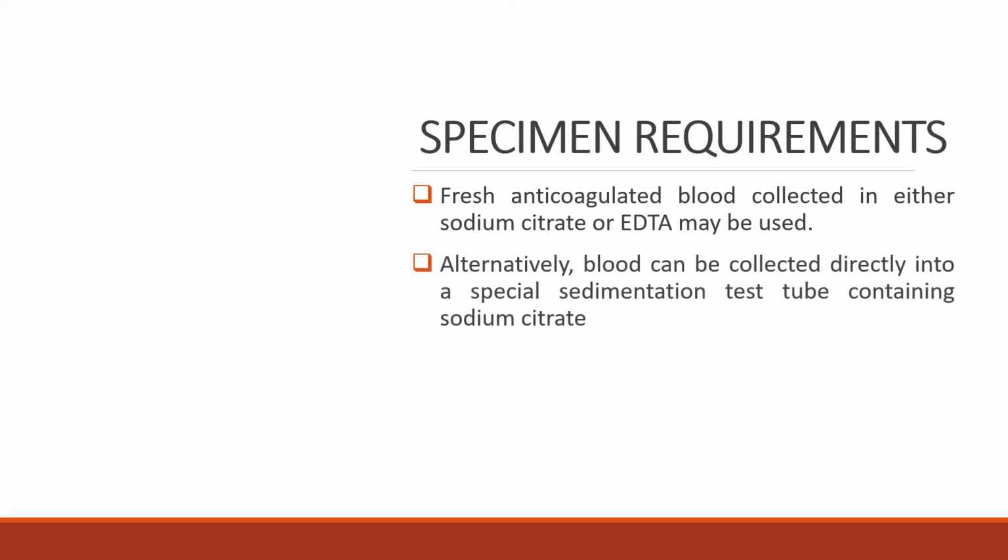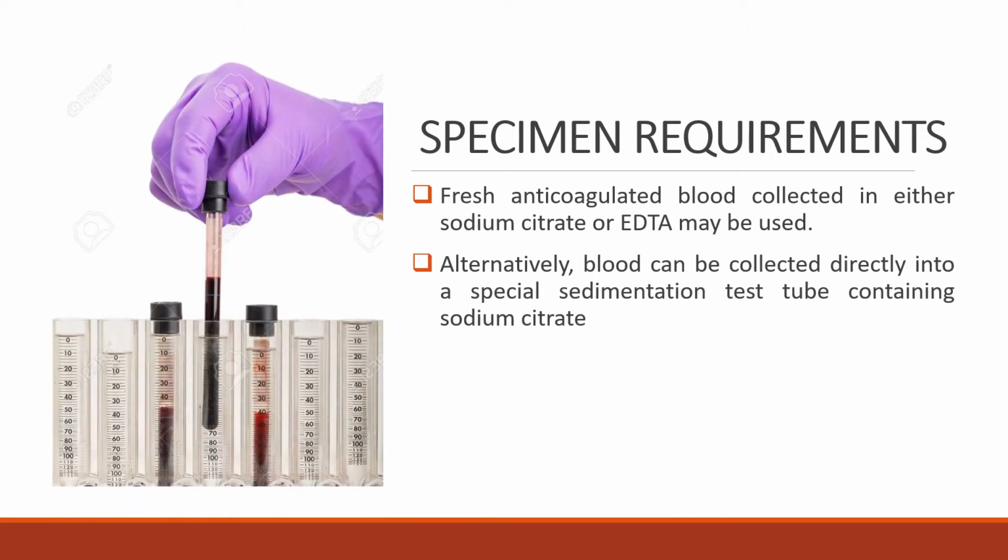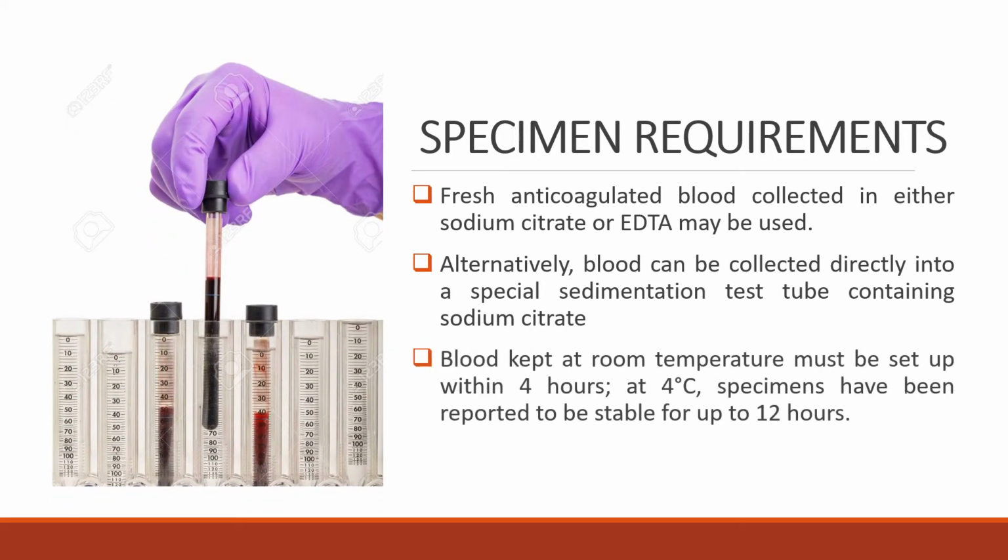Alternatively, blood can also be collected directly into a special sedimentation test tube containing the anticoagulant sodium citrate, as seen on the left portion of your screen. Blood must be kept at room temperature and must be set up within 4 hours. At 4 degrees Celsius, specimens have been reported to be stable for up to 12 hours. And lastly, hemolyzed specimens cannot be used. They must be rejected.